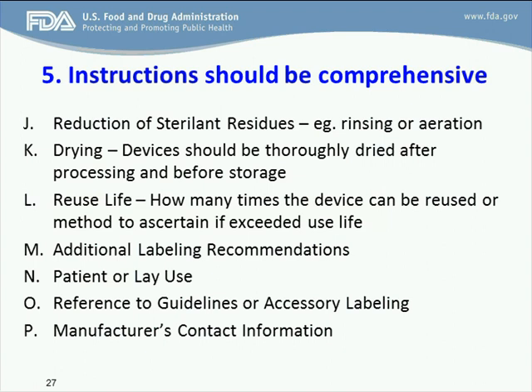Label instructions should include additional recommendations, such as for devices that are initially supplied non-sterile to the user and require the user to sterilize the device before use. These devices should be labeled non-sterile directly on the individual device packaging to ensure non-sterile product is sterilized before use.